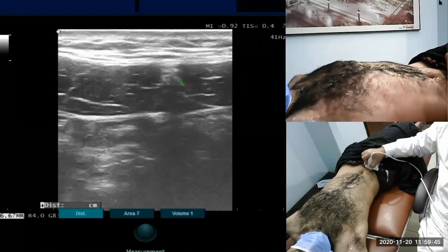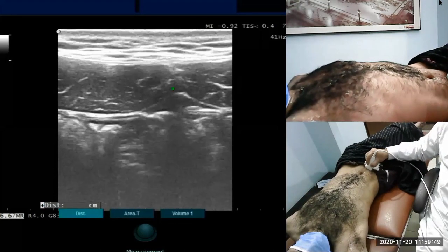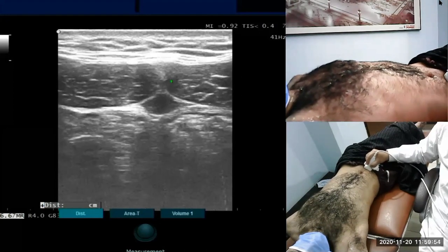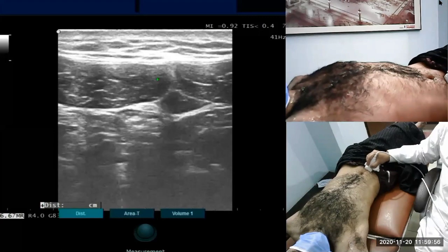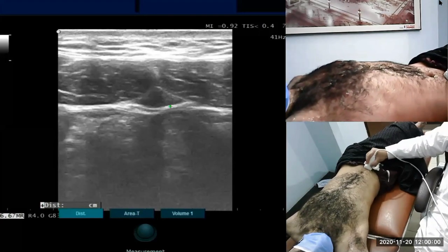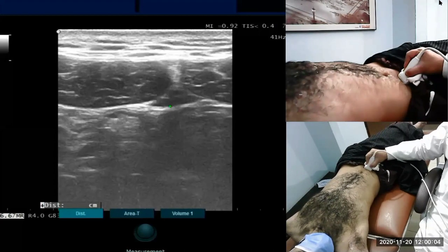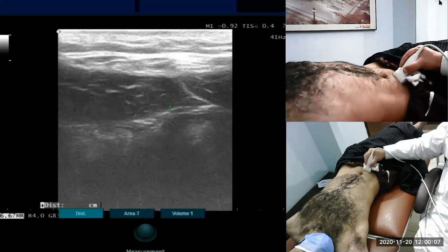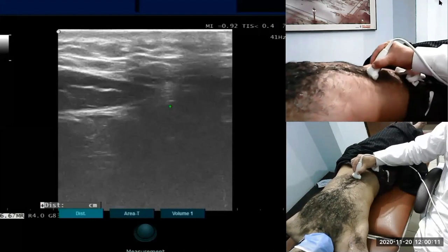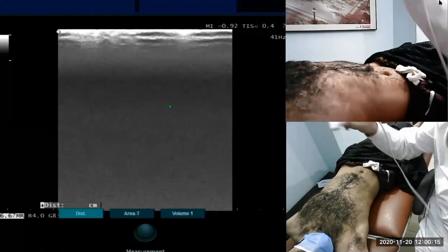So this is how we go. Linea alba here is very little muscles. They are adjacent to each other. You see this fat there. There we are. Going back, the umbilicus, going up. So, let's take it straight.